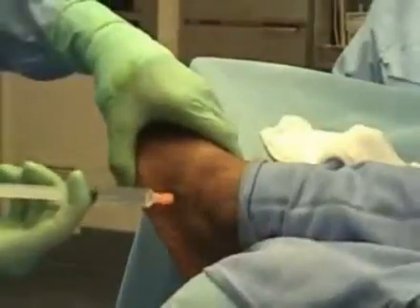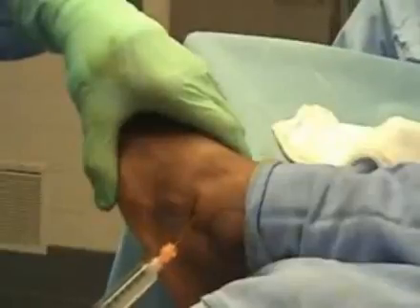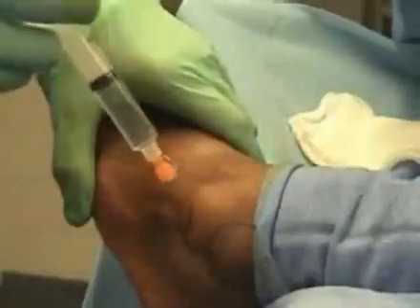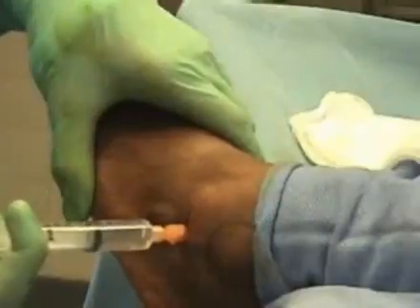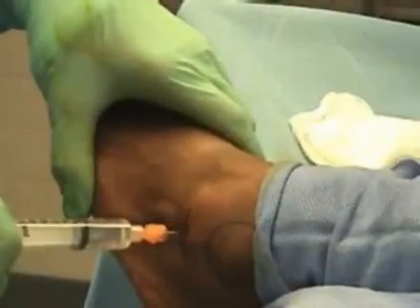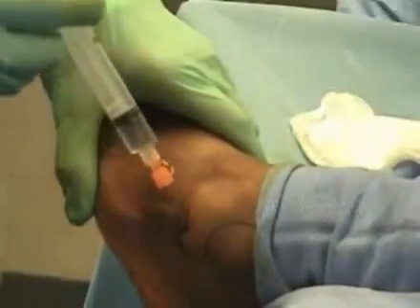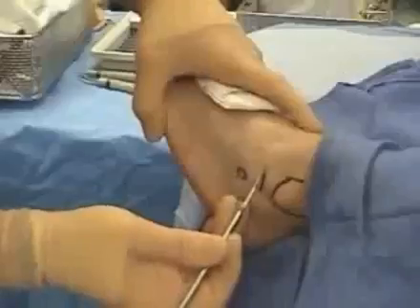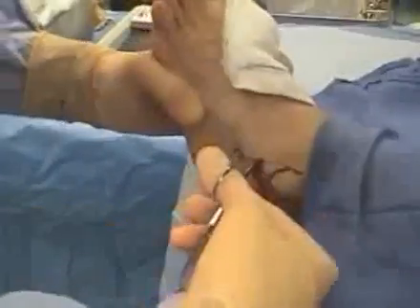The anesthetic mix that I use is a 10 cc syringe with just a sinus tarsi injection. I use 0.5% Marcaine with and without epi, and I also include 1 cc of dexamethasone phosphate into this cocktail, which significantly decreases patients' post-op discomfort. You can see the angle of the syringe going obliquely because the sinus tarsi runs from anterolateral distal to proximal medial posterior. You also want to put a little bit of that anesthetic mix up in the anterior talofibular ligament area. The incision is one index finger anterior to the fibular malleolus, about 1.5 centimeters long.